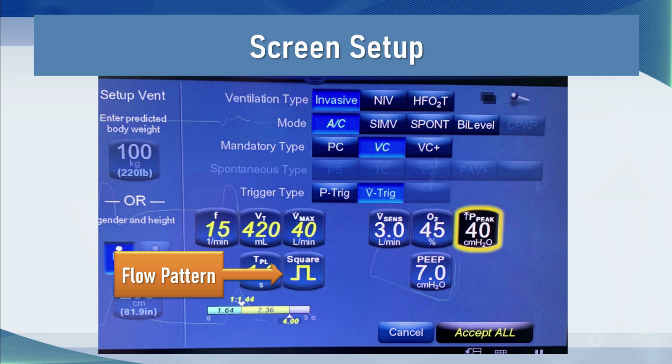But also there are times when the patient will start coughing, and coughs generate a lot of pressure within the airway, and you want that to be cycled off. You don't want that cough being stacked up on top of a tidal volume because it can cause a lot of stretch injury to the patient's lungs. So you must always put in a peak pressure limit on the ventilator.